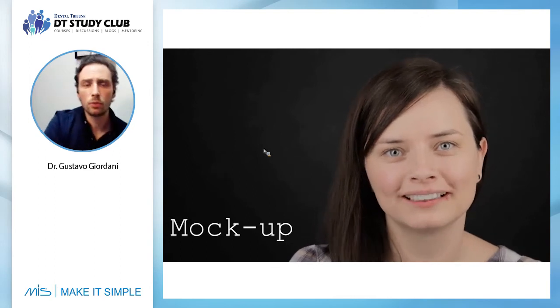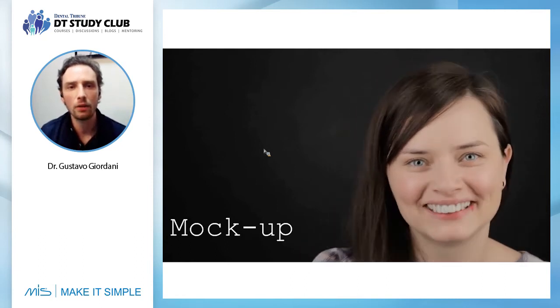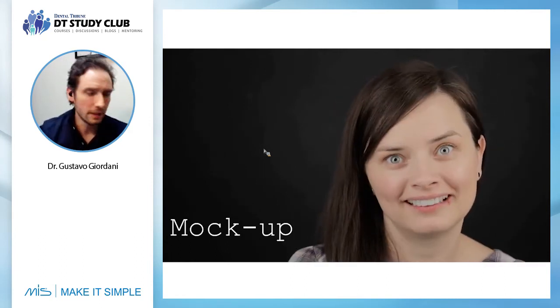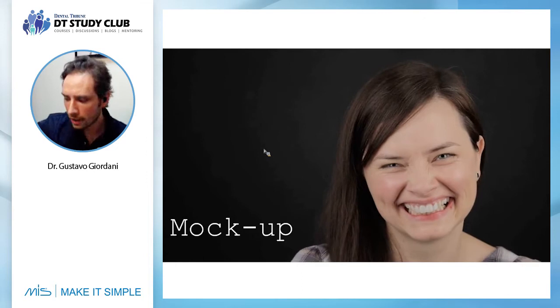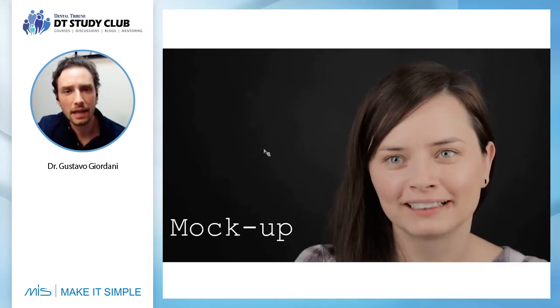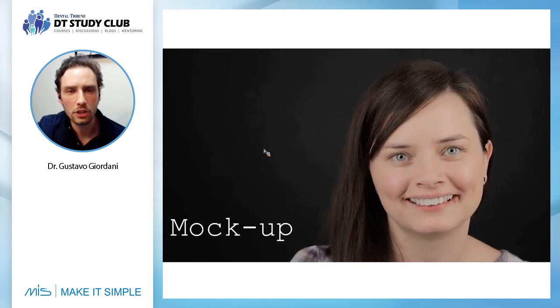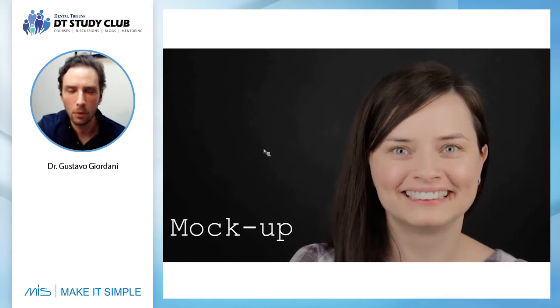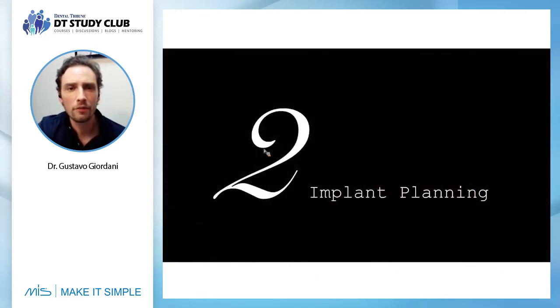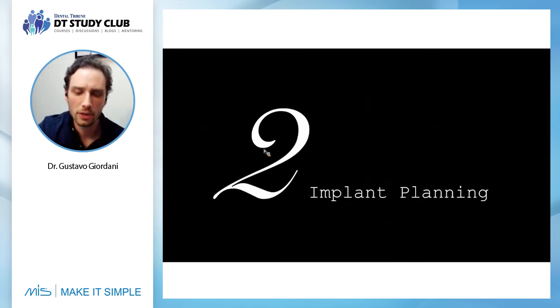So that's what we did in Monica's case. We did the mock-up using the Smile Cloud. We printed the model, we did the mock-up, and then Monica said yes to our shapes, and we decided to move on and decide the implant position according to this mock-up. So now it's time for step number two, which is to plan the implant according to this final restoration.